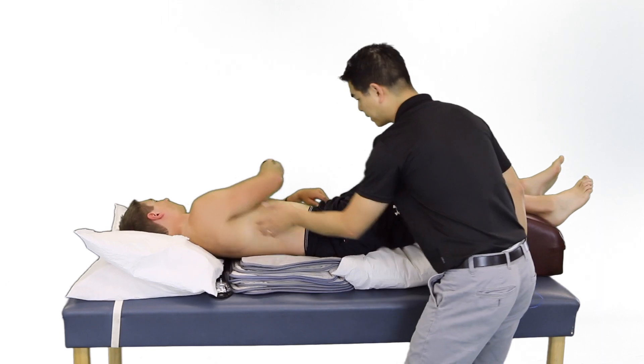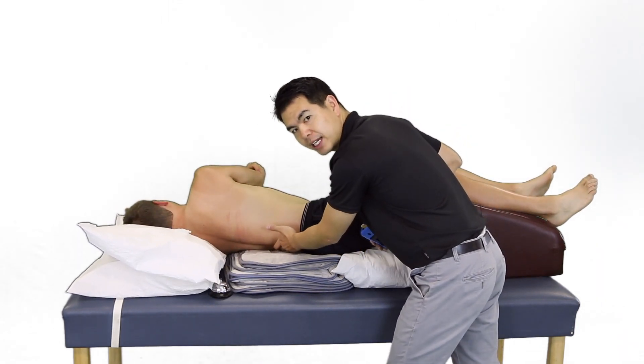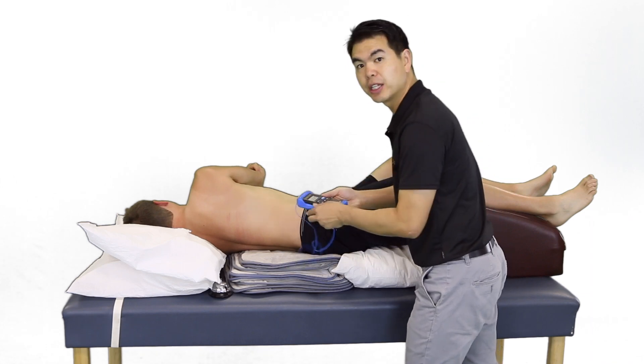Could you roll over just a little bit so I can take a look at your skin? It's normal to feel warm and to see a little bit of redness, and it's also wise to check the tissue temperature.